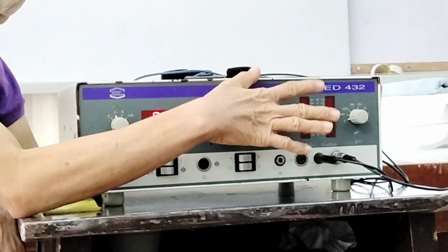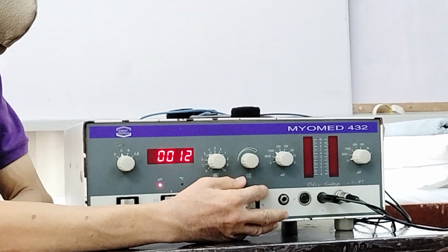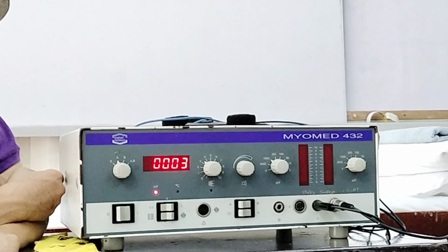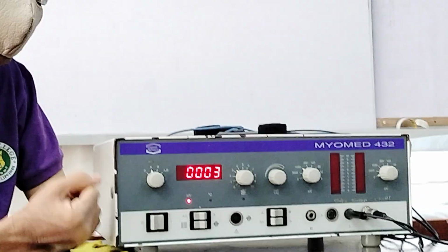Okay, so here, if ever you have a unilateral affectation, let's say one side ang affected, your basis there would be on the good side. So try to assess first the good side up to which level ang kaya sa good side.